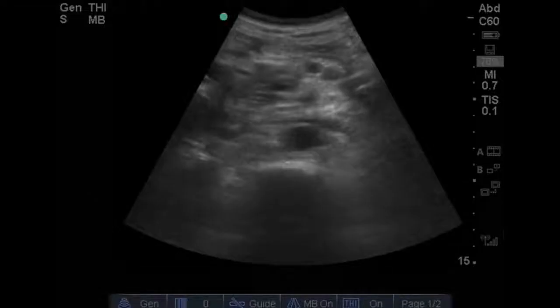What you'll see is the anterior surface of the spinal column with posterior acoustic shadowing because of the bone. So you can see here on this ultrasound image, we can identify the spinal stripe. That's the anterior surface of the vertebral body with posterior acoustic shadowing because of the bone. Because the spinal stripe is identified there, and we are in a transverse plane, we know on our indicator side that is the patient's right and their left side. That tells us that this vascular structure anterior to the spinal stripe and to the left of midline is the abdominal aorta.